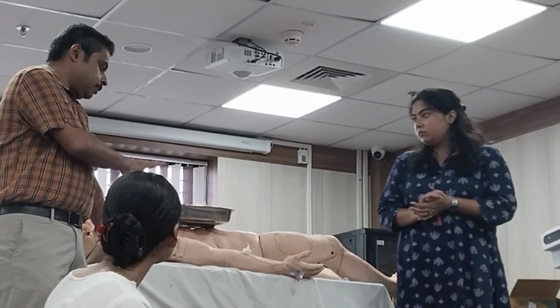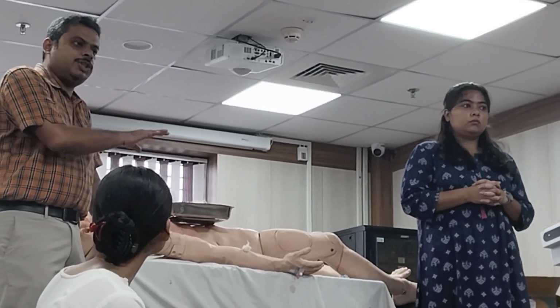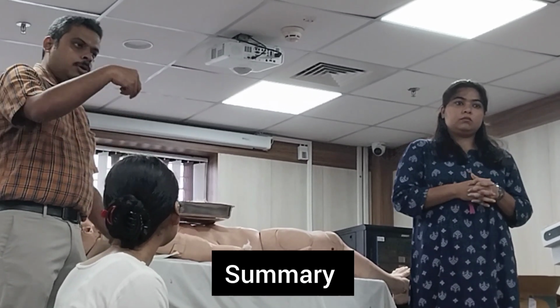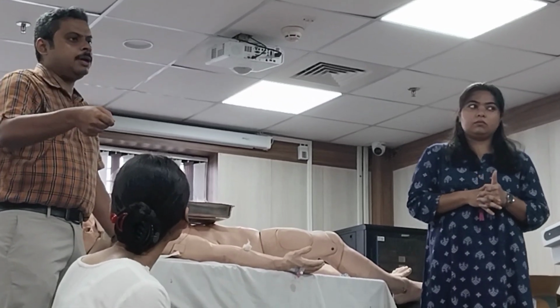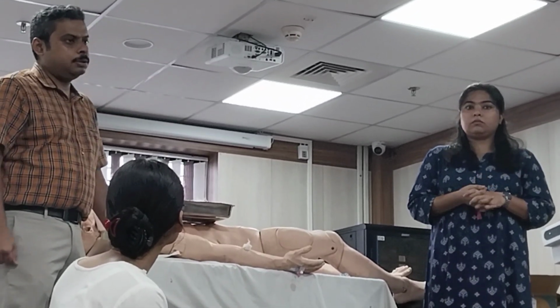The procedure for creating an IV access, that is putting in a cannula, and IV drug administration is the same. Put the tourniquet, choose the vein, palpate the vein, clean up the area, inject the needle, see whether blood is coming out, and then you push in the drug. Simple.